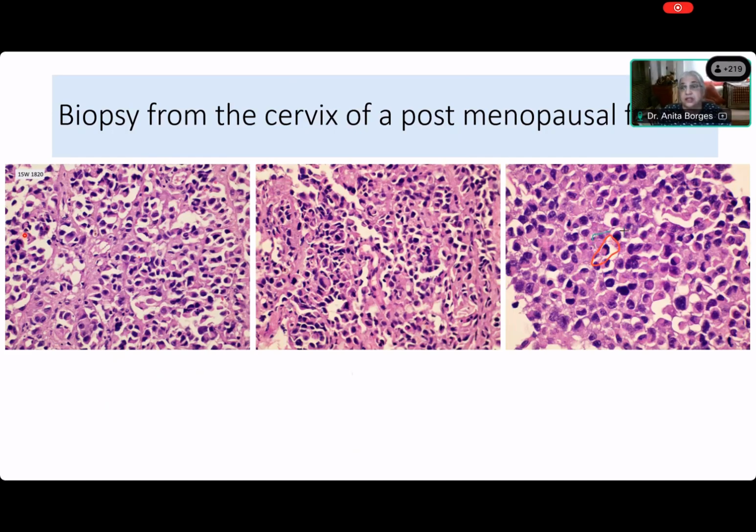So you think that is signet ring. Everybody agrees with Sneha that this is signet ring? Come on, Lalit. Do you agree that this is signet ring? Lalit has disappeared. Deepak, is this a signet ring? No, ma'am. Why is it not a signet? If you say no, you have to tell her why it's not signet ring.